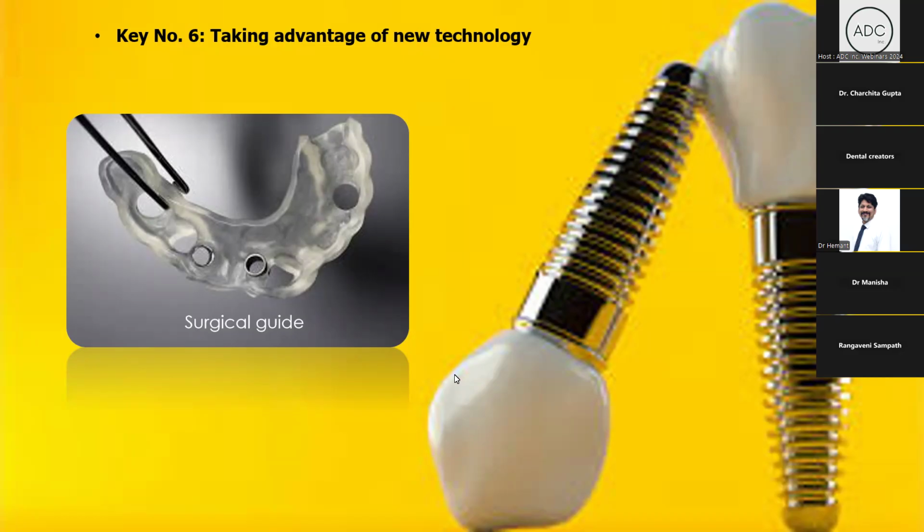The holes which are made in the guide are simulating the implant size only.